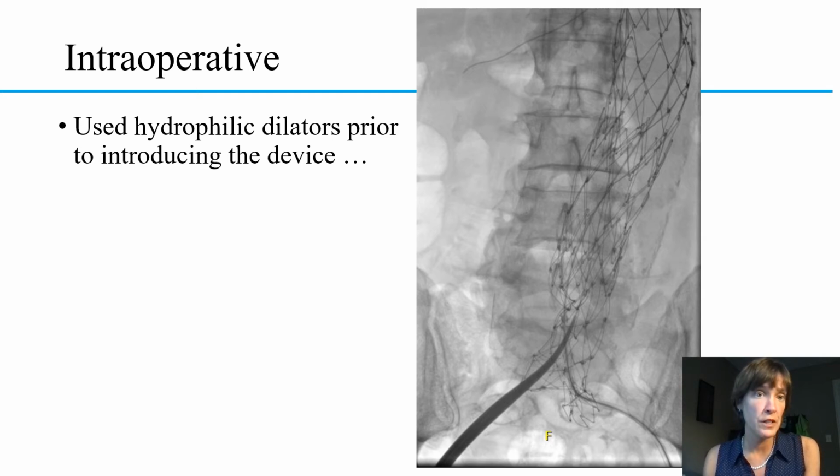We used hydrophilic dilators prior, which is a common practice for us prior to introducing the device. And what you're starting to see here, without a video of this, you can't tell, but this is as far as we could get that hydrophilic dilator to go without encountering significant resistance.